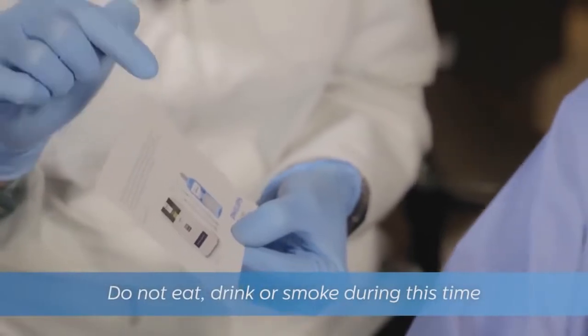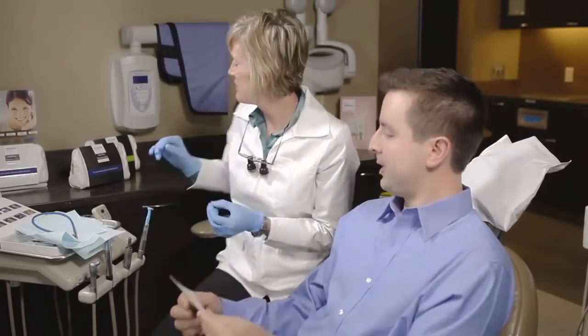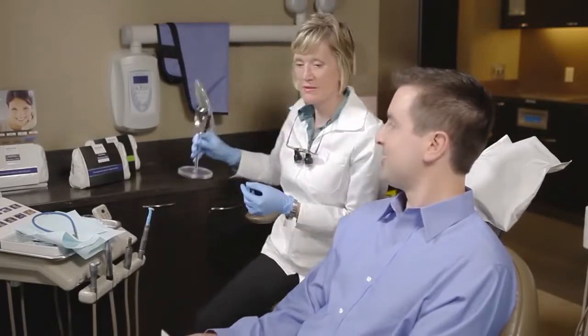The patient should not eat, drink, or smoke during this 30-minute window, but can otherwise go about their day as the varnish is colorless and nearly invisible.